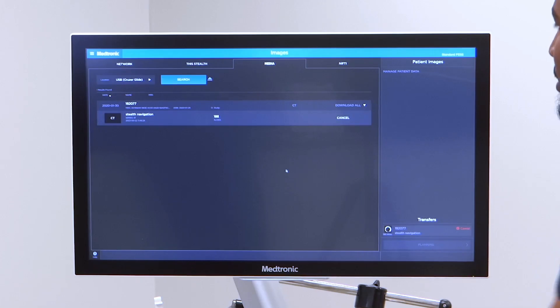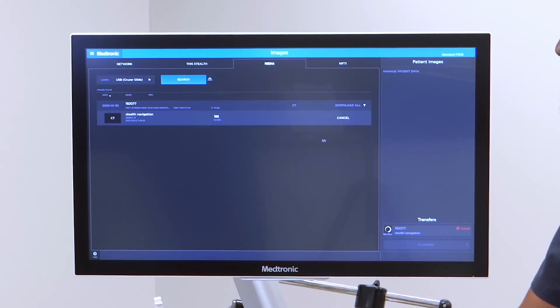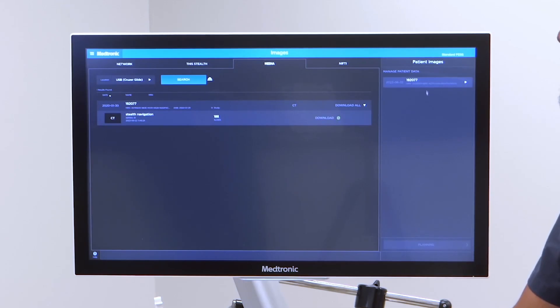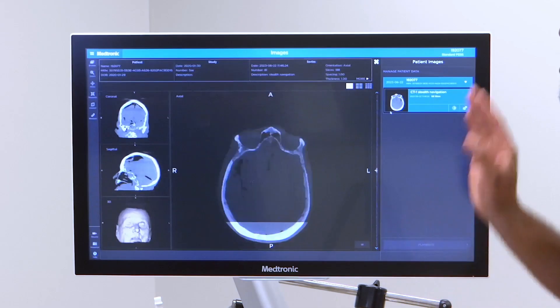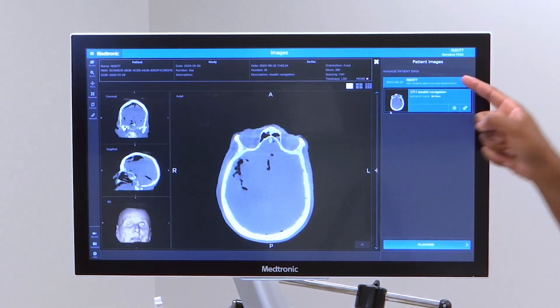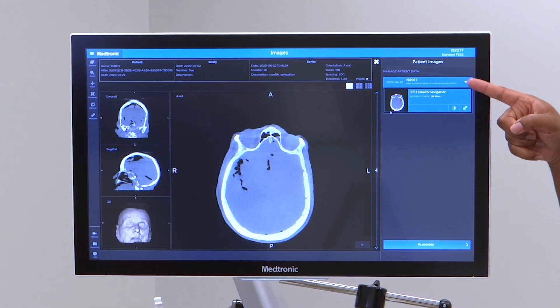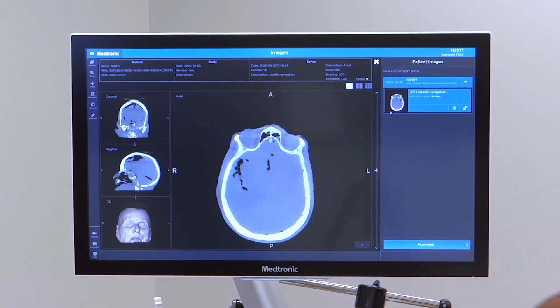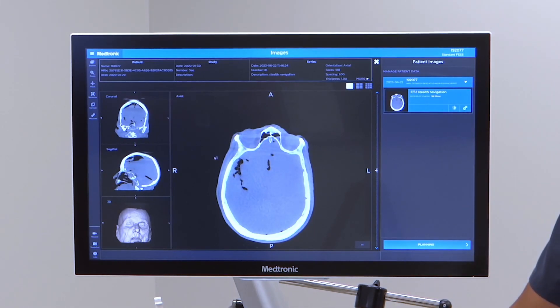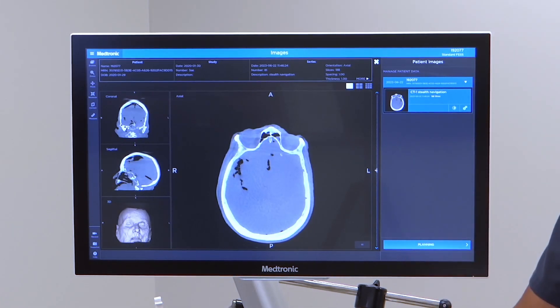I'll hit download — it takes a moment to download. Once it does, you can click on this panel right there and it'll take you to the next screen.